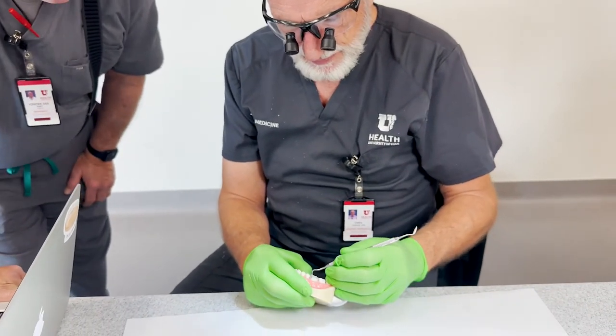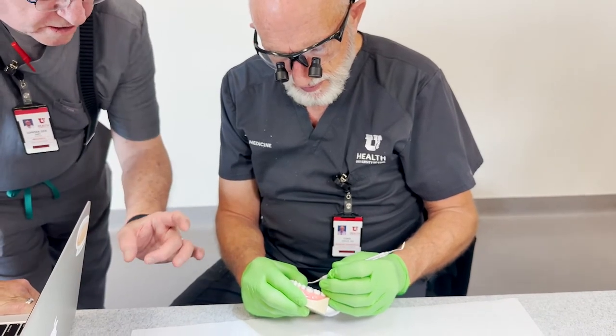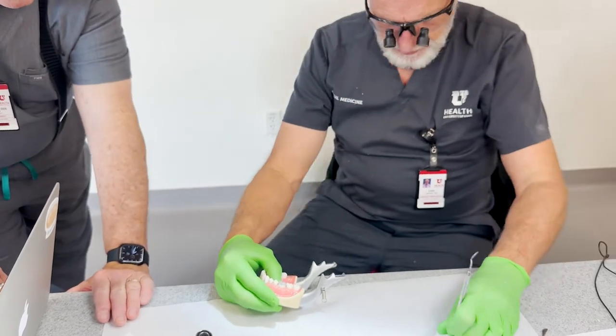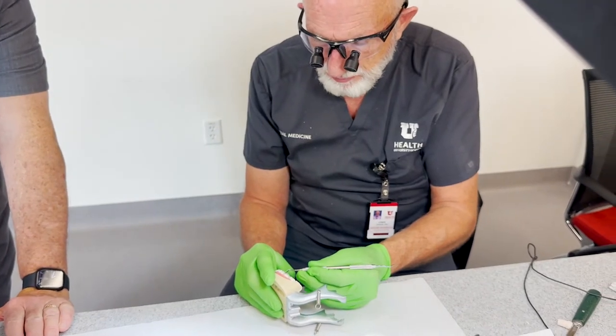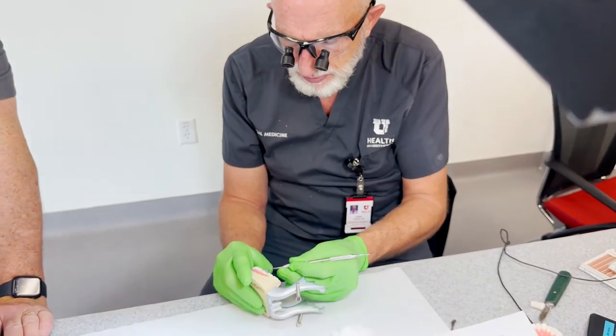Okay. Chris found some green inlay wax in these smaller tin containers. It'll make it a lot easier to look at occlusal contacts than the gray. Are you okay if she orders? Yeah, whatever you want. That's fine. I think it'll make it easier to grade.